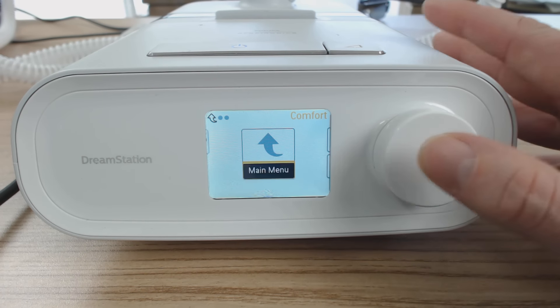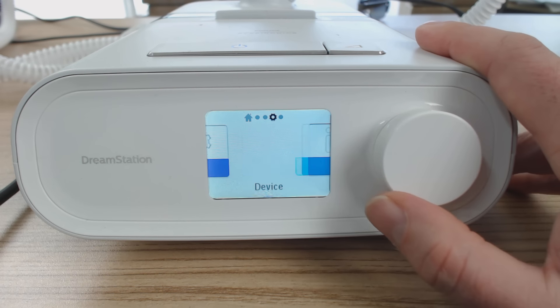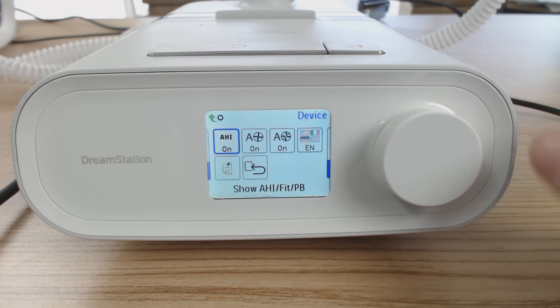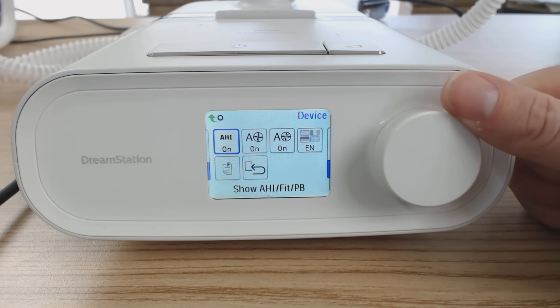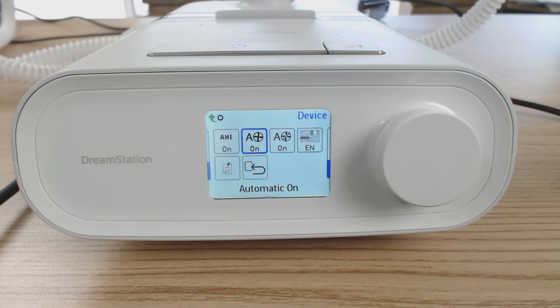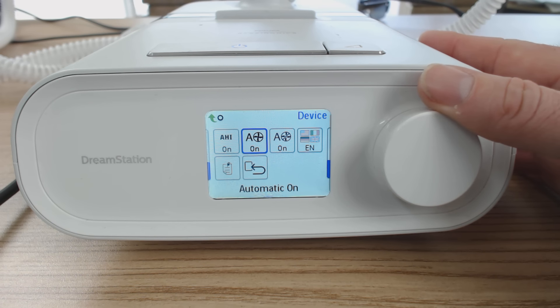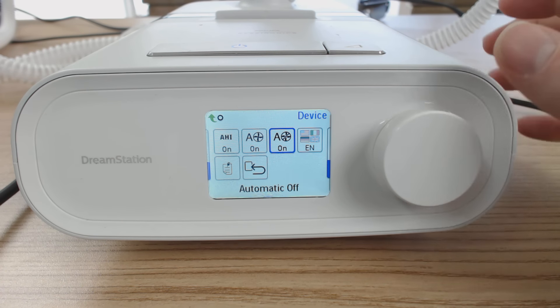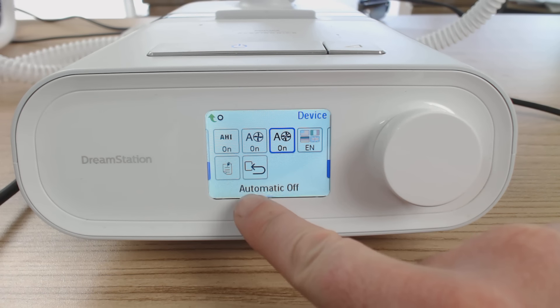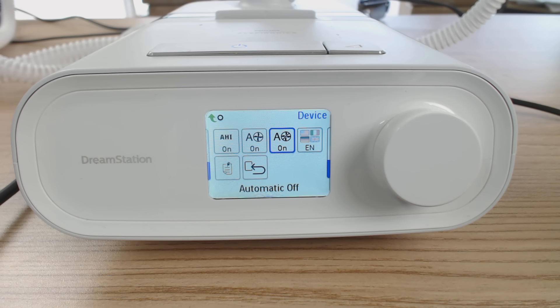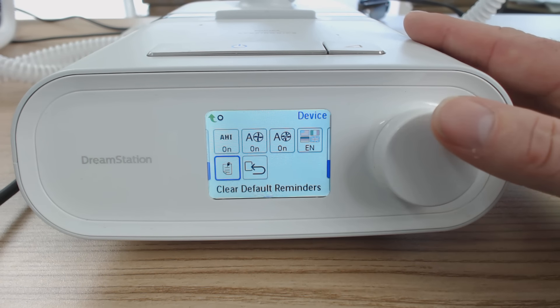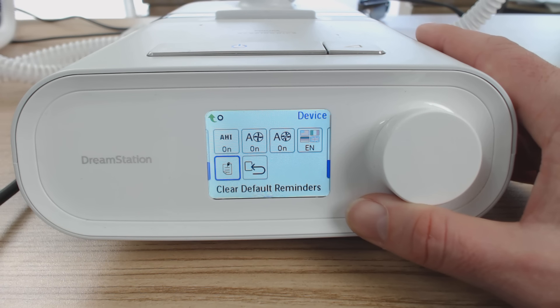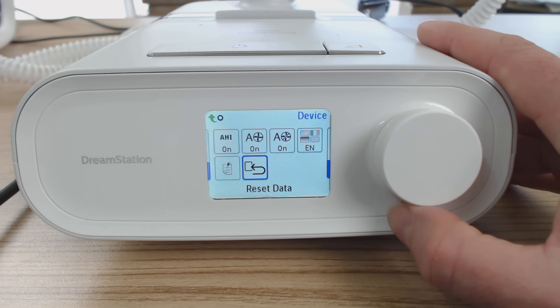We'll continue clockwise to the right and click main menu. Going across again, we have device settings. We want AHI on because this enables us to check our apnea hypopnea index in the patient menu. Automatic on — you put your mask on, start breathing, and the machine automatically turns on. Auto off we also want on, which means if we take our mask off during the night the machine turns off — we get up to go to the bathroom and the machine turns off. Language is English. Don't clear the default reminders — we want them on, as they remind you of things like changing your filter.